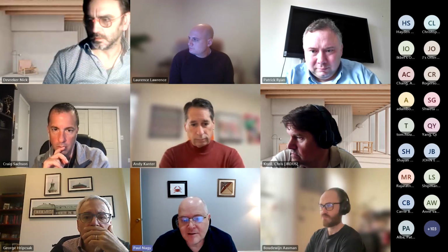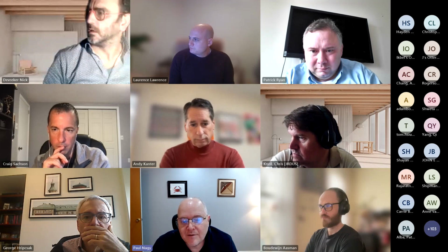Yeah, Boudewijn, thank you so much for presenting this. This is a great part of the multimodal vision for OHDSI. I like how you're using the OHDSI data model to then help define your cohorts, then kick off a pipeline. Was the pipeline specific? If I wanted to say I want to get the MRs from today and from a year ago for the head, I want to do subtraction, can I build custom pipelines with this type of environment?